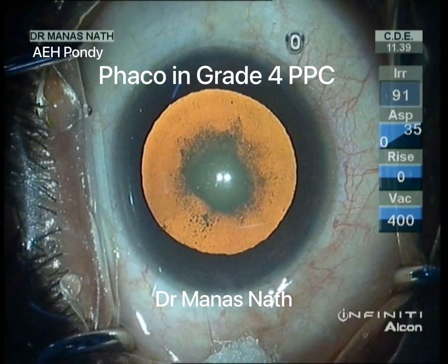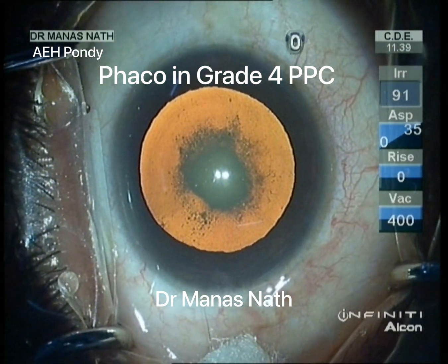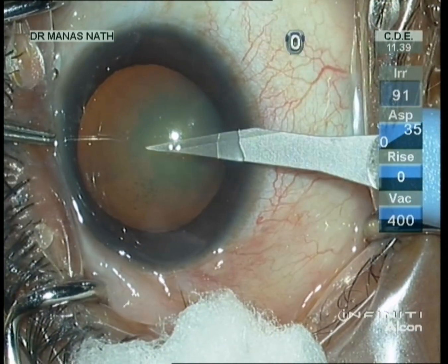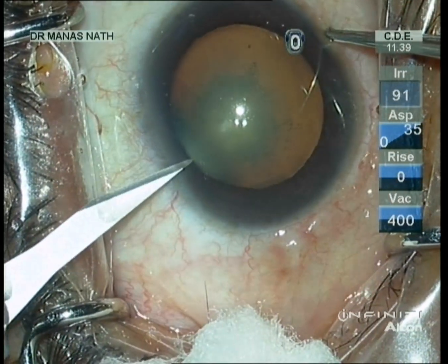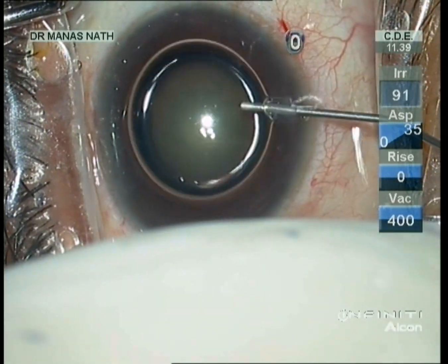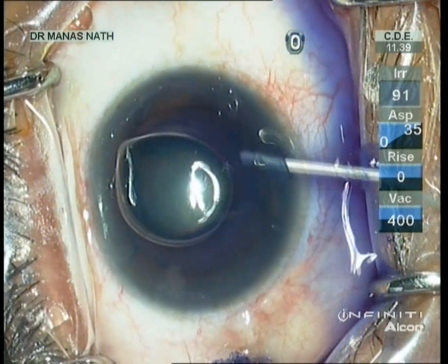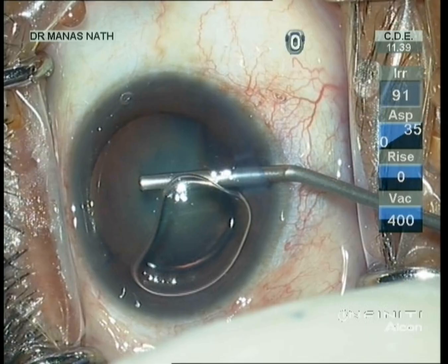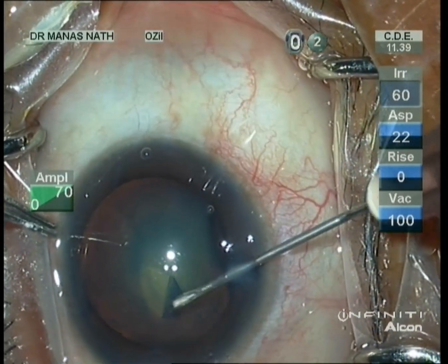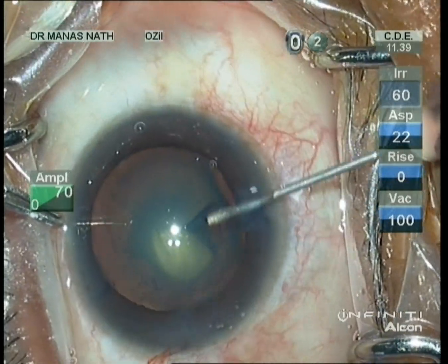This is the case of a phaco in a grade 4 post-polar cataract. According to Daljit Singh classification, grade 4 PPC is when the PPC is associated with nuclear sclerosis. Here you can see the nuclear sclerosis is almost grade 3. Now I am initiating the capsulorhexis.